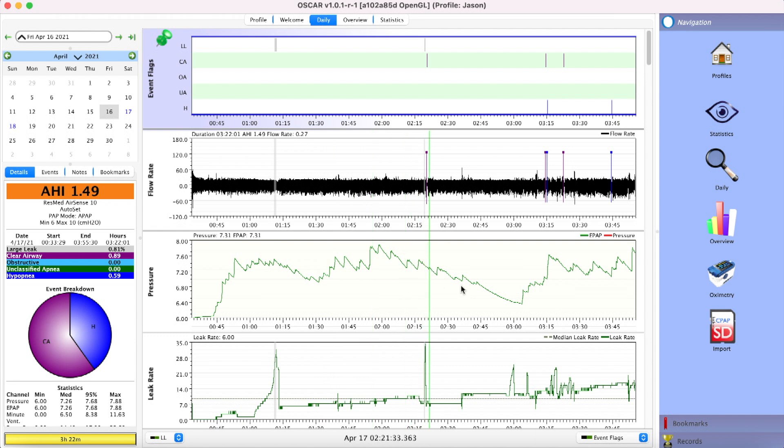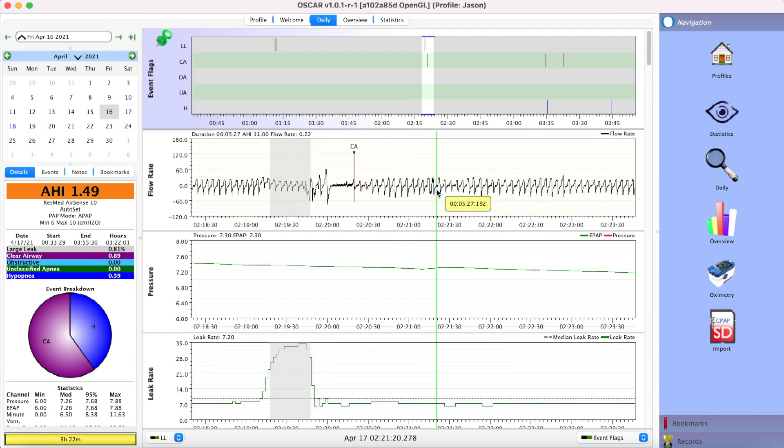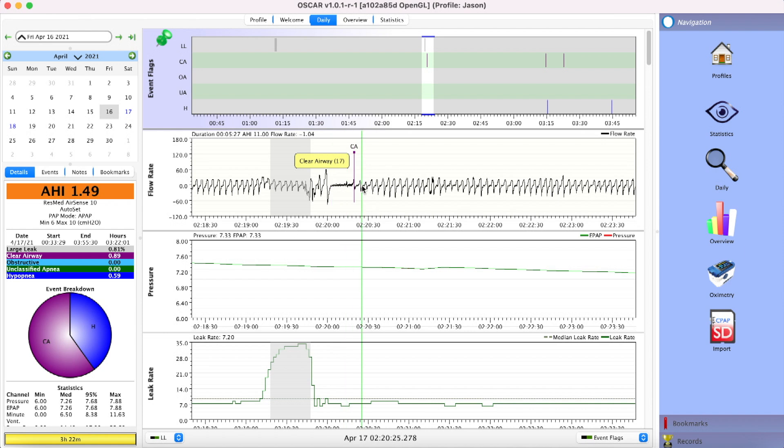Check out the pressure — it's all over the place. Is that good or bad? Look at this: central apnea. Oh my god, am I dying?